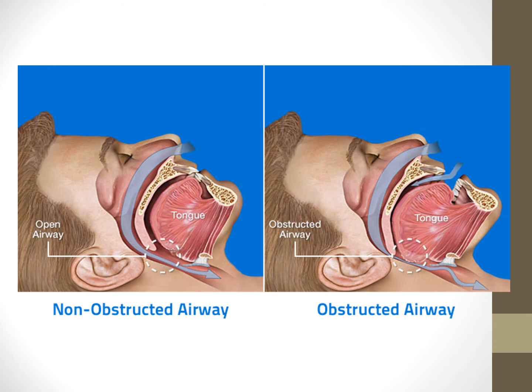All right, this is the ultimate goal. Hey, get this obstructed airway, get rid of it, right? We're going to get rid of it by somehow stenting open the airway, whether it's the nasopharynx or the oropharynx, or we can even use a CPAP. I had a pediatric patient. She was about 14 or so, extubated, and she was a neurological injury patient. She had a head trauma, and she would just sort of have that snoring, obstructive sleep apnea look to her when we extubated her. So instead of reintubating, I asked the physician what their thoughts were on trying CPAP for a little bit. So I just used a little bit of CPAP with her.